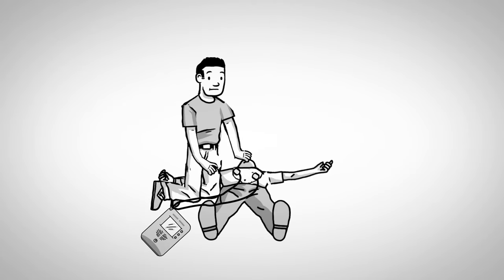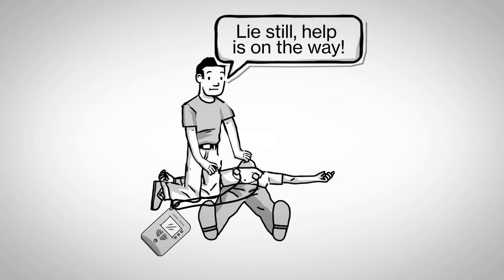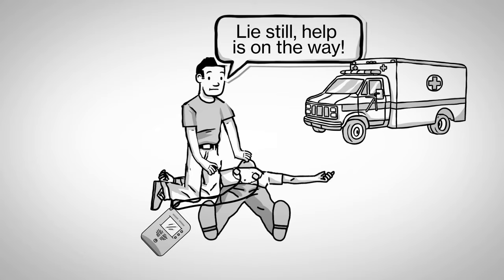Stay with the person. If they start to move or try to get up, keep them calm and at rest until medical help arrives.